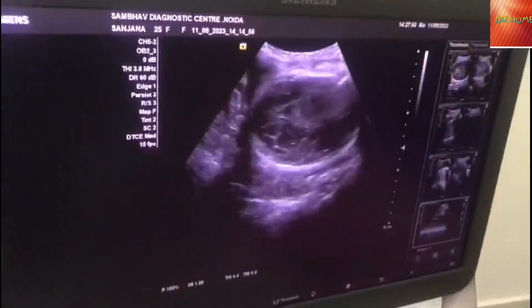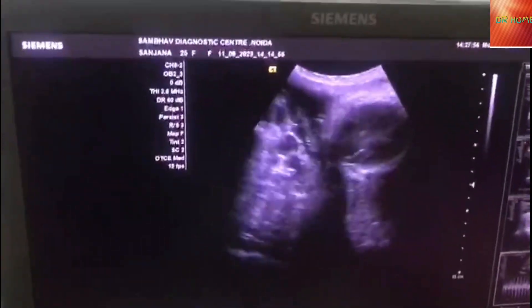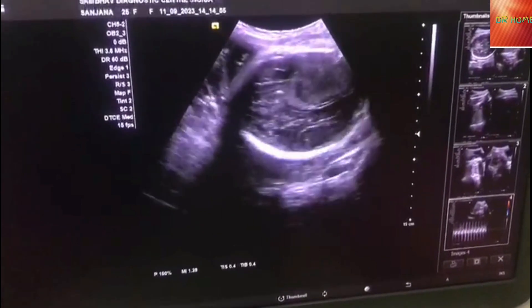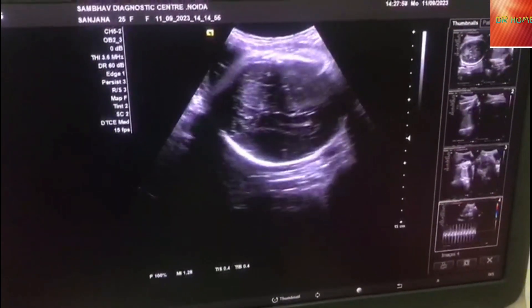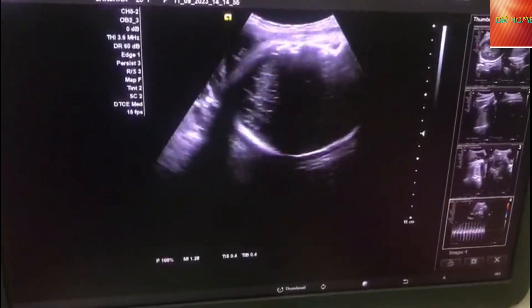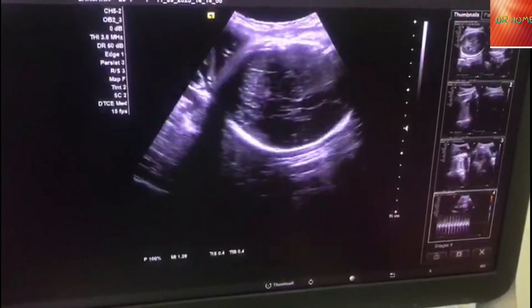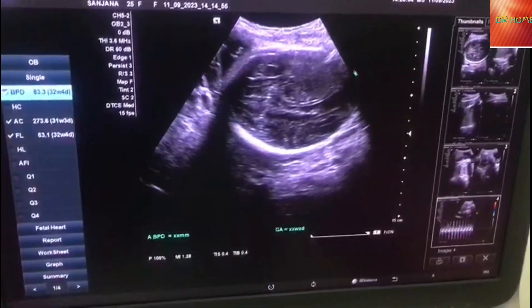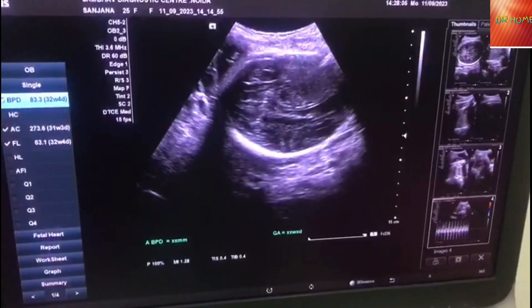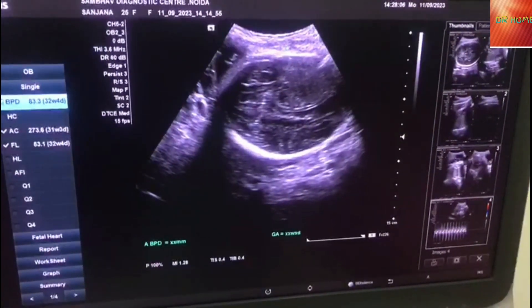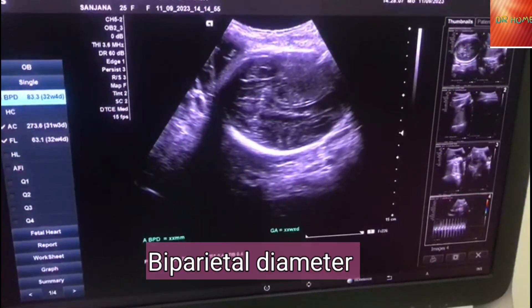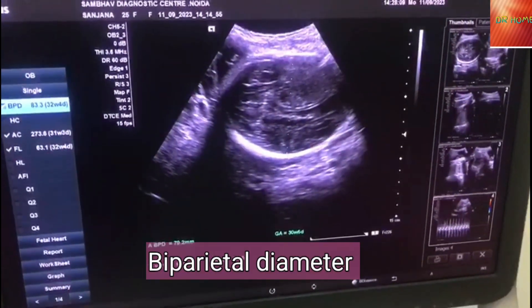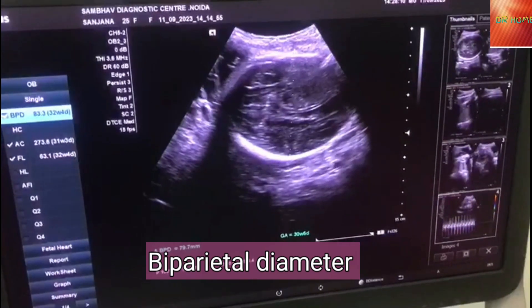This is the child's head. We take a parameter called BPD, which is biparital diameter. We also take the circumference of the child's head.